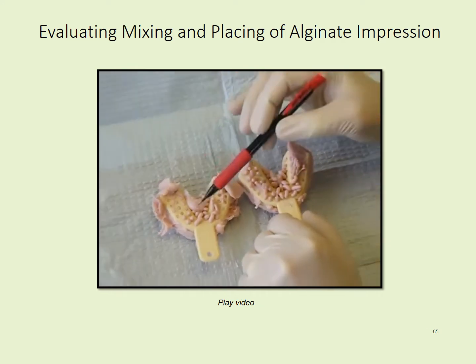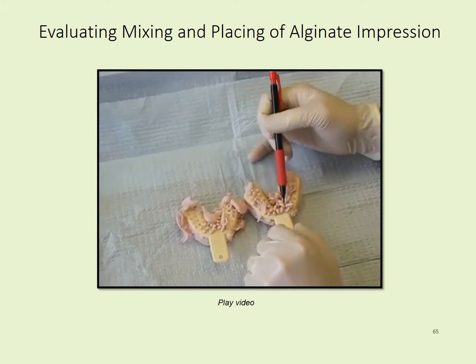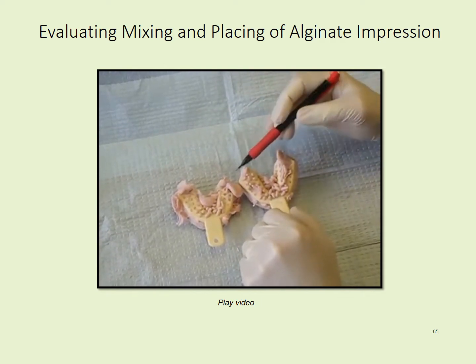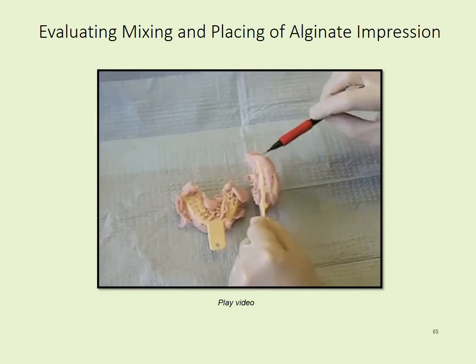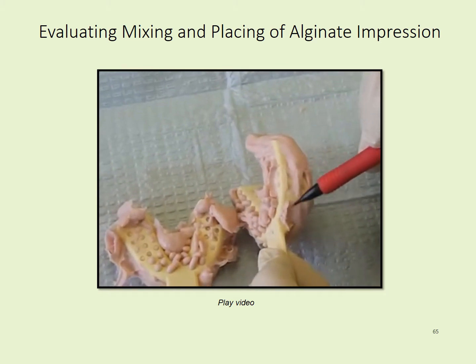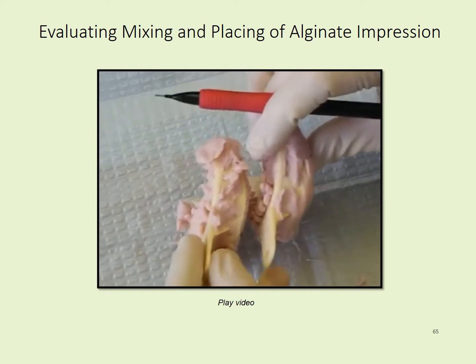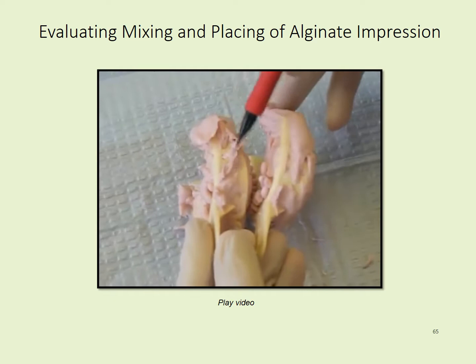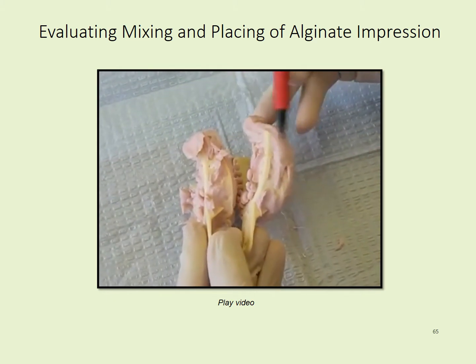And so please make sure that when you do seat the material, if you're not getting all of the material to push through those retention holes, then you probably have a mix that's too runny. Looking on the sides, you can see how well defined those borders are and how it's coming up and over and around the tray. The lip line is right here, whereas on this one, comparing both side to side, you can see the material is kind of flimsy and just all over the place. There are no really well-defined borders here as opposed to here.